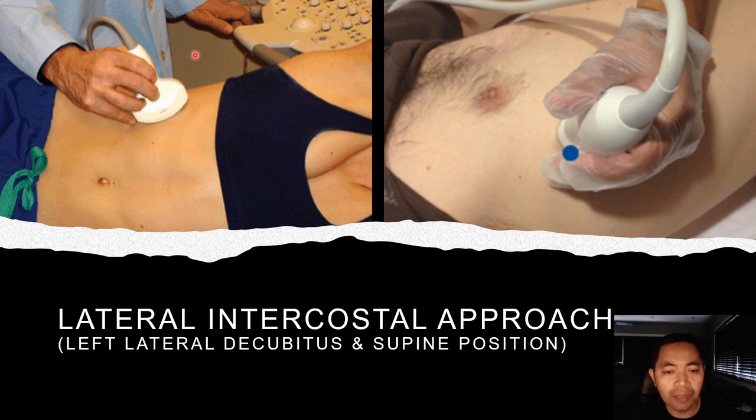This may be difficult for beginners as the ribs can cause issues in imaging. But personally, this is my go-to imaging approach for imaging the gallbladder when presented with difficult to image patients, especially when the gallbladder is located higher up.